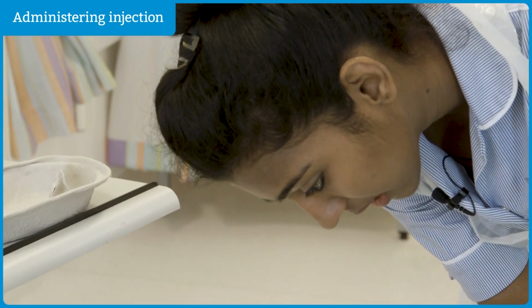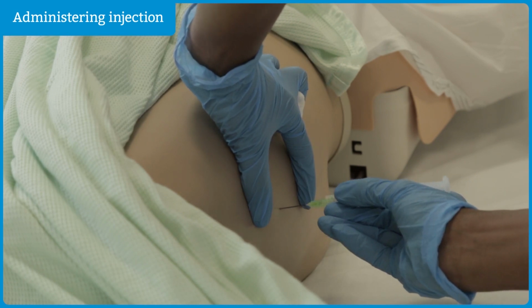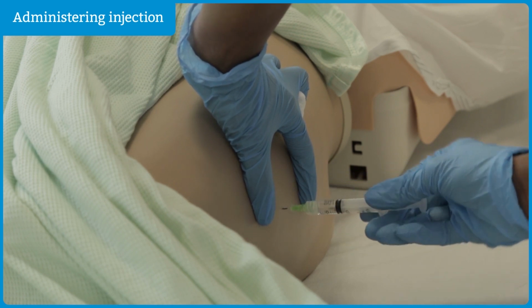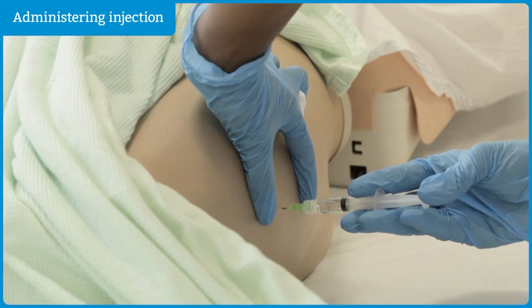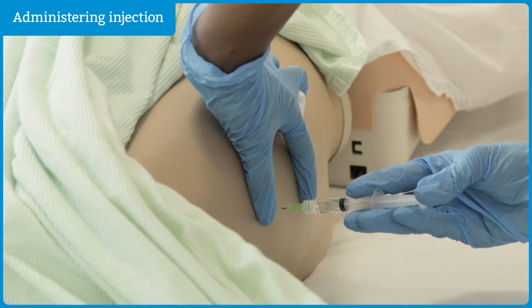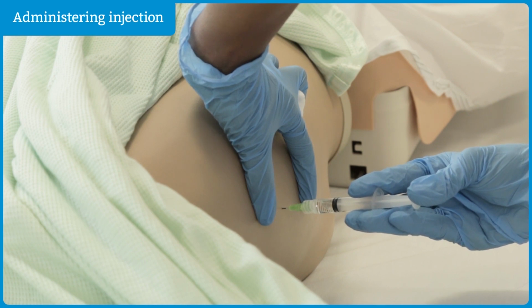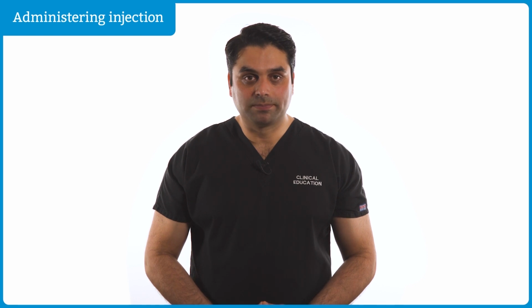All right, Anne, can you please take deep breaths? Yeah, will do. And I'll make sure that I leave a centimeter of the needle out, and I'll aspirate to check if there's any blood. I see that there's no blood. I'll be injecting at the rate of 1 ml per 10 seconds. So it's 1, 2, 3. Allow the needle to remain for another 10 seconds before withdrawing swiftly.